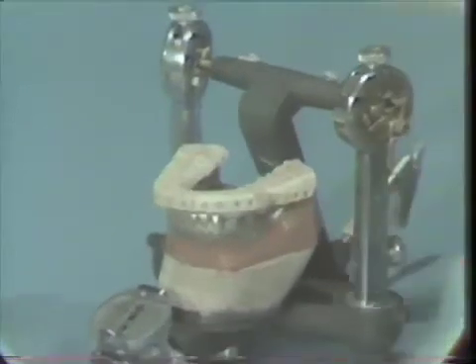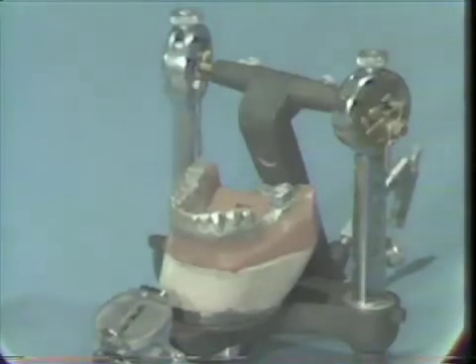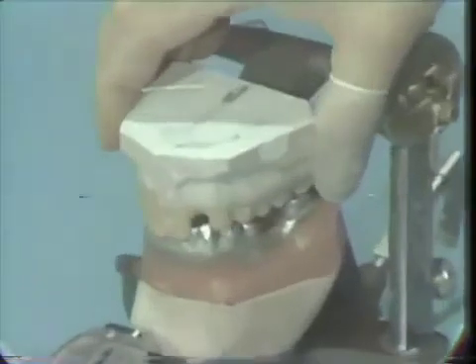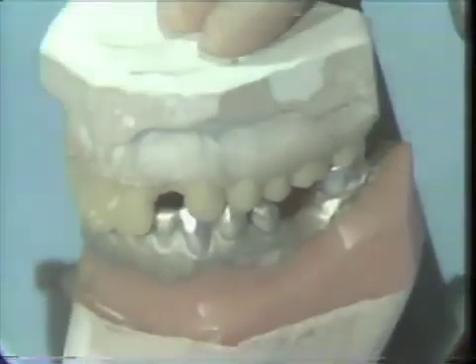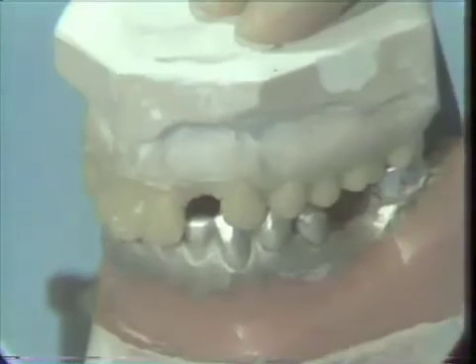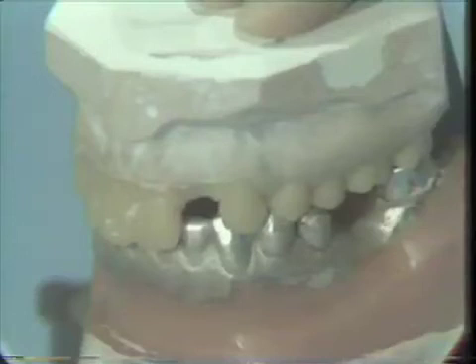We would also like to have an anatomic cast positioned on the articulator so that we can develop our buccal contours, and here again we will use the aluminum shell crown and use this to mount our anatomic cast, and again you can see that it's quite stable. After we have these two casts mounted on the articulator, we're ready for our wax-up procedures.